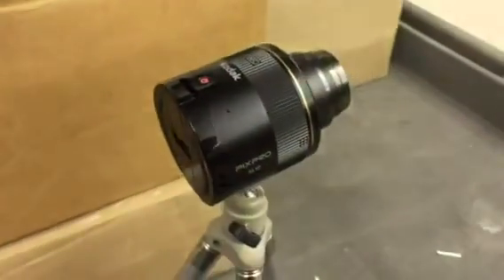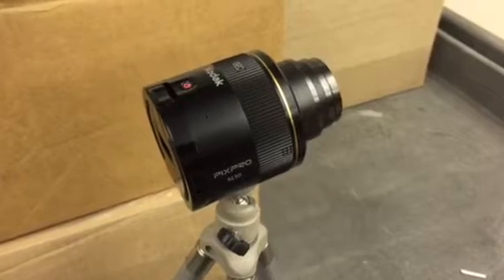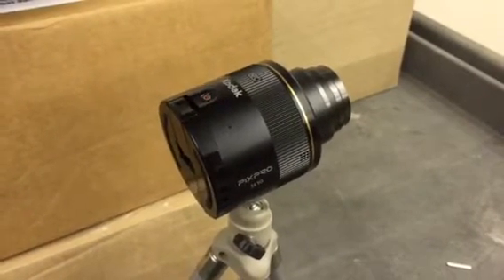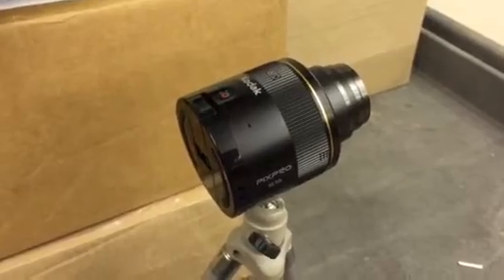Basically it's a camera lens that connects with its own Wi-Fi signal to an iOS device or Android device like an iPad. So let me just show you briefly how it works.